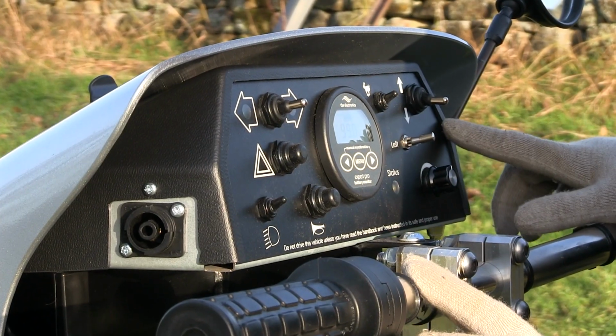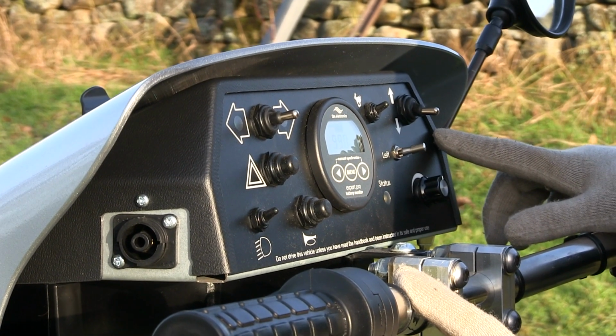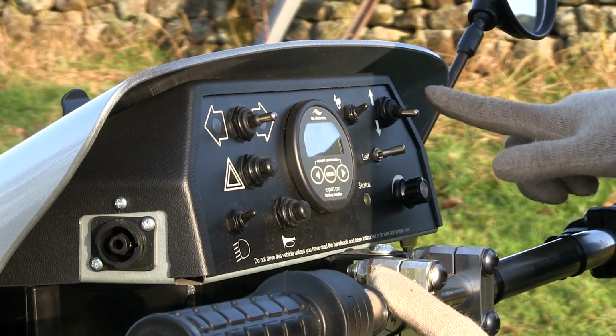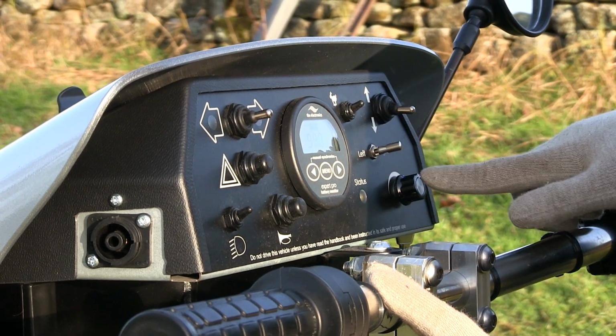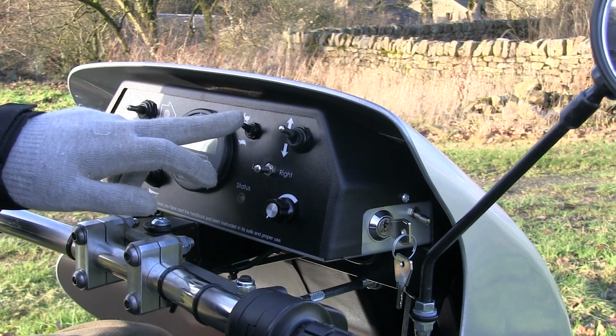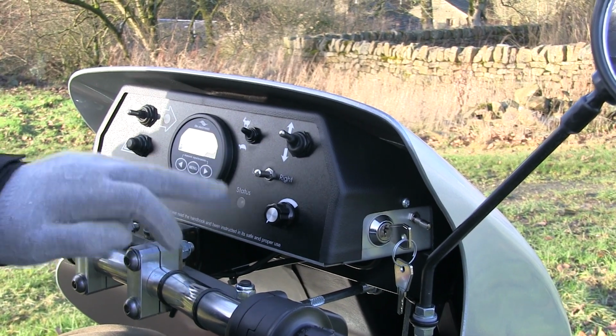On the right hand side of the dash we've got probably the more crucial instruments. We've got the hare and the tortoise, we've got forwards and backwards, and we've got the speed. The hare and the tortoise setting I think of as being the gears.